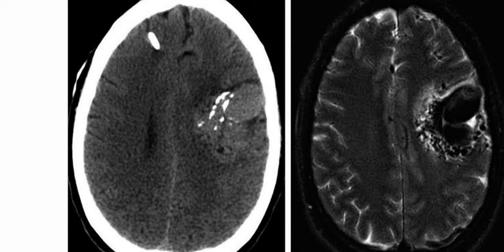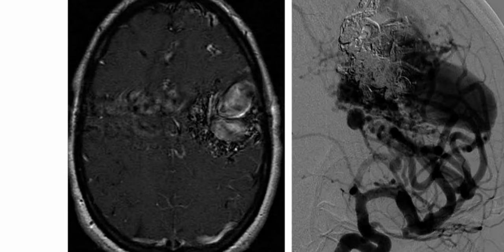So these are the images of a 44-year-old woman who has presented with headaches and seizures. So this is the axial CT scan, and next is the axial T2 MRI sequence. Here you can see that there is the post-contrast sequence provided, along with this digital subtraction angiogram image of the left internal carotid artery.